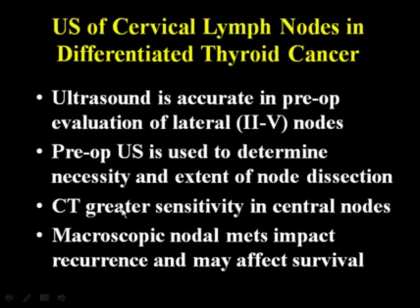CT is reported in the literature to have greater sensitivity in the central compartment than ultrasound. So typically, if I see an abnormal central compartment node, I'll report it to the surgeons, but they know that they need to decide at the time of the thyroidectomy if they need to go on and have the patient undergo a central compartment node dissection. Macroscopic nodal mets are known to impact recurrence, and it's unclear in the literature if they actually affect survival.